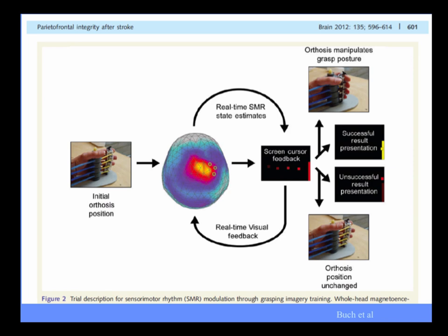But interestingly, tDCS, which is transcranial direct current stimulation, which is direct current electrodes on there, we can actually do that inside the scanner because this direct current, although it's an electrical signal, it's not moving. So it doesn't create a moving magnetic field. So we can actually record during direct current stimulation. So that's another neuromodulation technique that's of big interest. And so MEG is one of the few places where you can really record in real time relative to that kind of neuromodulation.